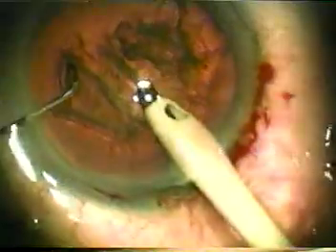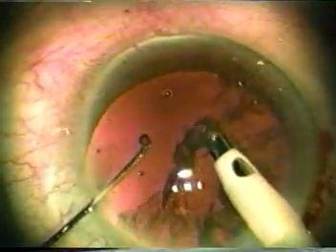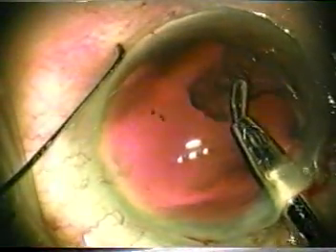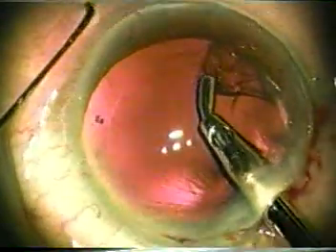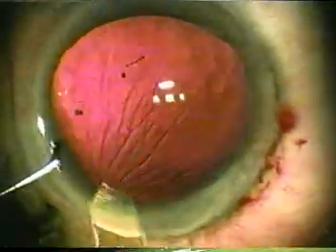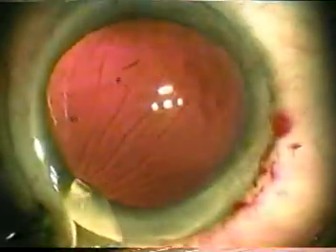Most patients with AMD have cataracts associated with the disease. For the implantation of the lens, once the cataract has been removed, a viscoelastic substance is generously injected into the eye. The limbal incision is extended to 140 degrees and the lens is covered with viscoelastic in order to avoid any trauma to the endothelium.